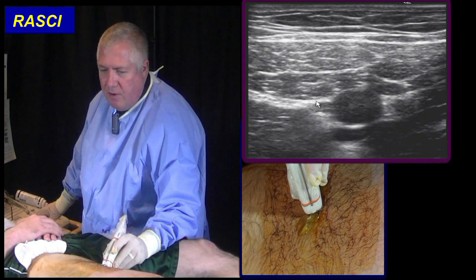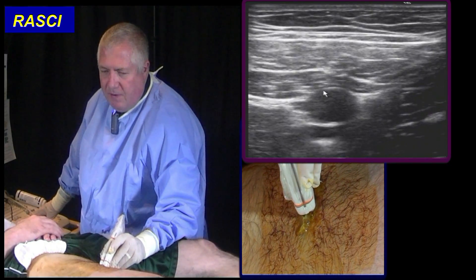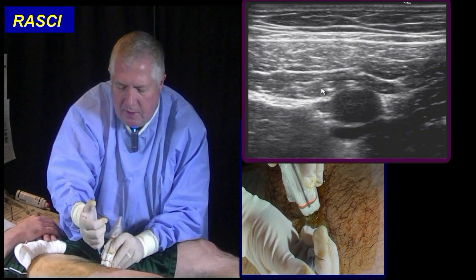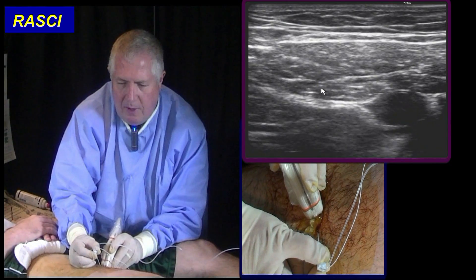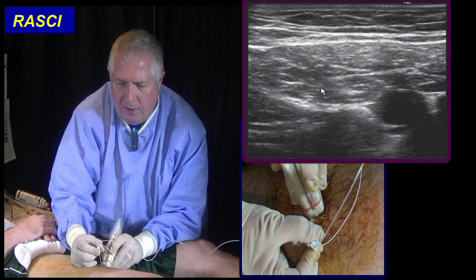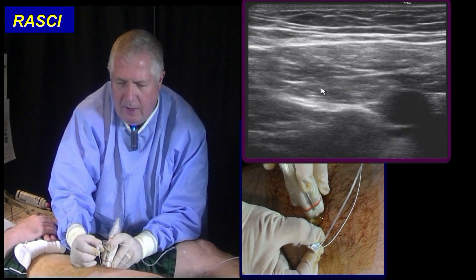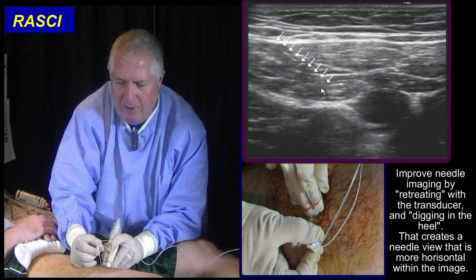We're going to try and inject drug in that corner but not into a vessel. Local anesthetic — a little mosquito bite. There's my needle. I'm going to advance adjacent to the artery. Now I can improve the image of this needle — you see it's about 45 degrees downward.